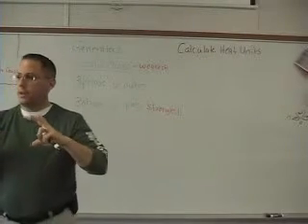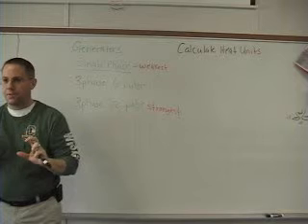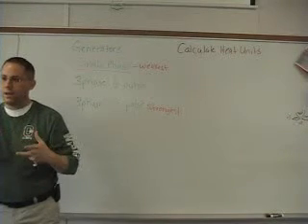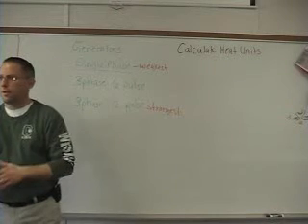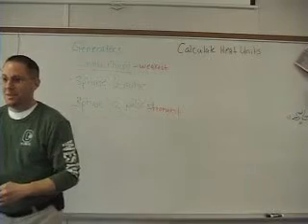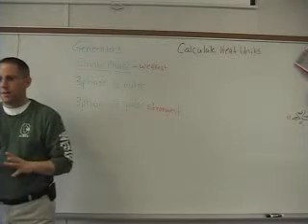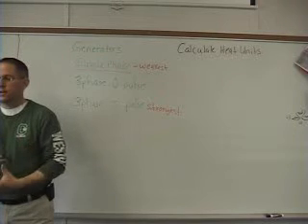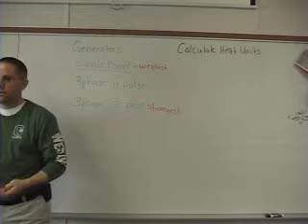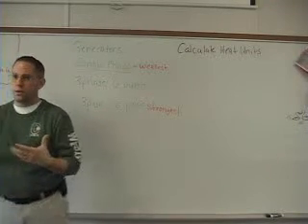Your X-ray tube that contains the anode and the cathode can overheat, just like your car could overheat. If you're ever driving your car and it starts smoking and overheats, what's the worst thing that could happen? Well, it won't explode, but part of the engine can actually crack because it gets overheated, and it's going to cost a lot of money to get it fixed. The X-ray machine could do the same thing. If you get it too hot, it could crack open, and then it's not going to work anymore.